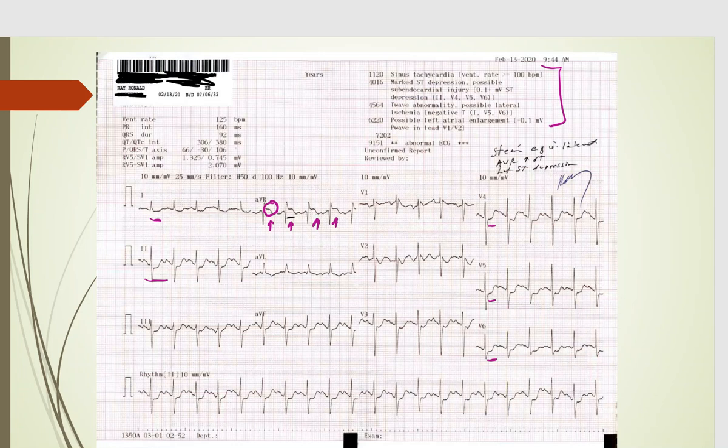The degree of ST elevation in AVR can correlate with mortality in patients with ACS. If you have ST elevation in AVR of more than 0.5mm, it's about a four-fold increase in mortality. Greater than 1mm is a six to seven-fold increase. And if it's greater than 1.5mm — which this one is — it's associated with mortalities upwards of 20 to 75 percent.